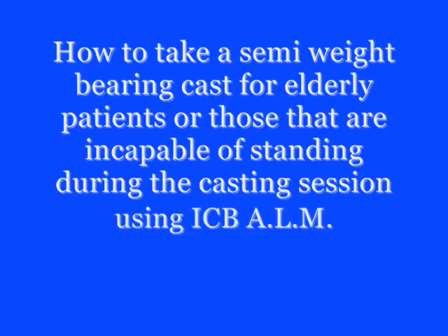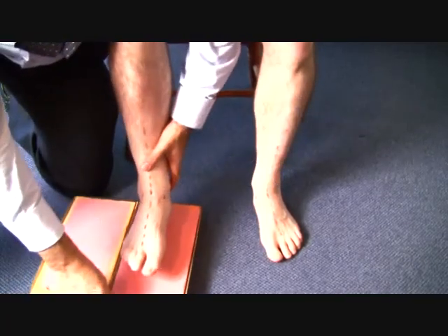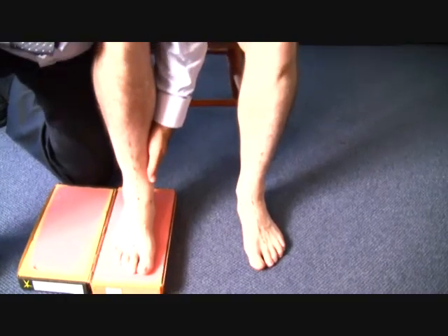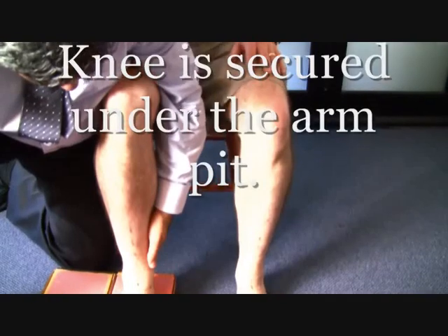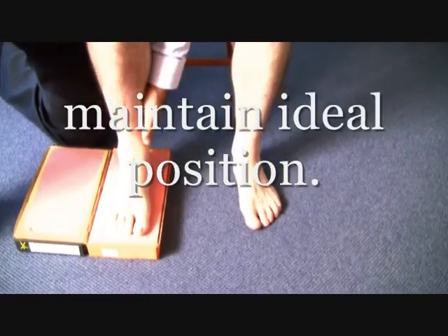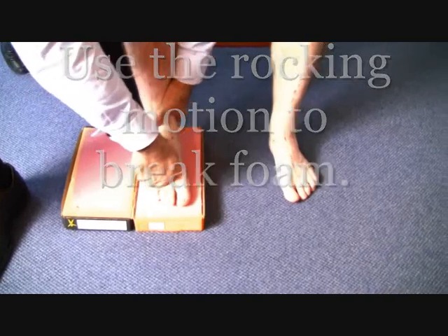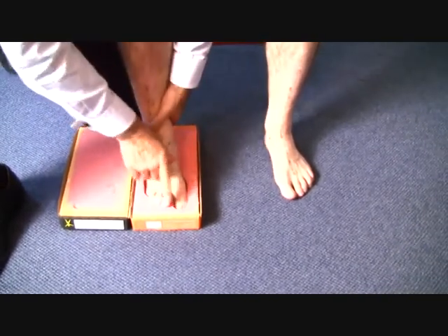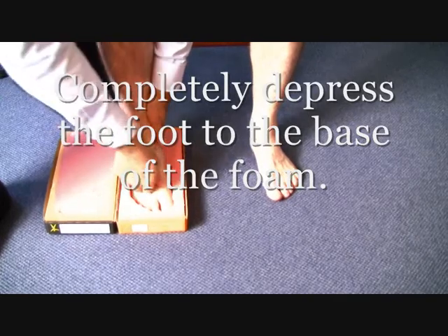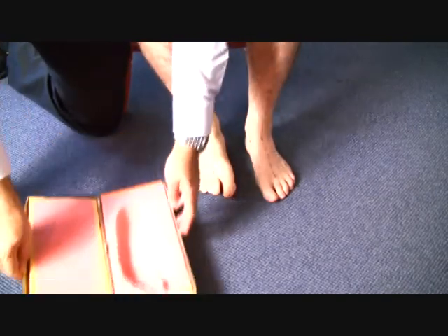The ICB ALM can also be used in a semi-weight-bearing casting procedure. When the patient is seated, place the foot gently on the foam. Position the knee underneath your arm and your left hand should be positioned so that it's controlling either inversion or eversion, so that you're able to maintain the neutral or ideal position. Use a rocking motion to completely depress the foot to the base of the foam. Ensure that the toes, first metatarsal joint, heel and forefoot are depressed completely. Once this is completed, you can now start to cast the opposite foot by removing the foot and then transferring to the other side.